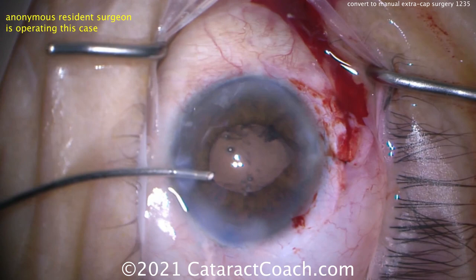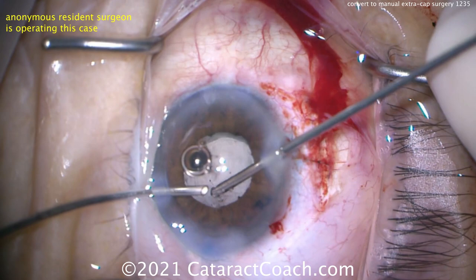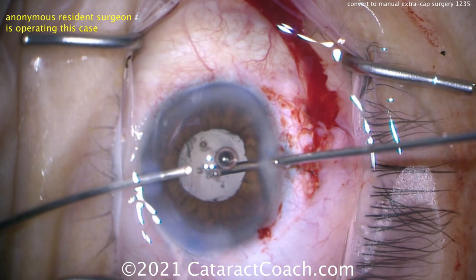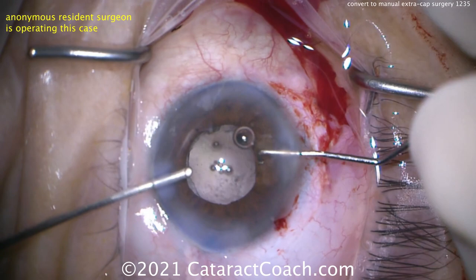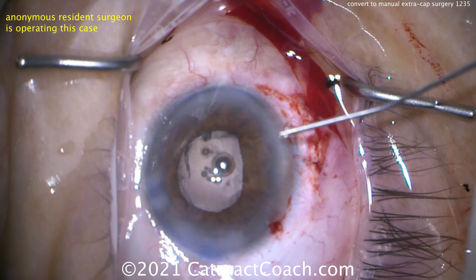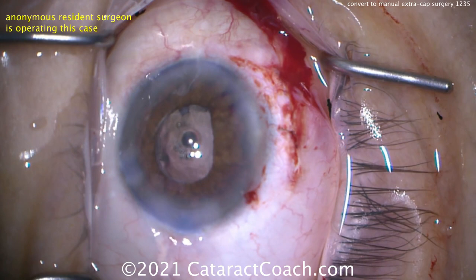I think you can learn to control your foot and do a good job. Cleaning that up — it looks pretty good. You can tell there's vitreous prolapse. Here comes some triamcinolone. Surprisingly, not a whole lot of staining in the anterior segment. Doing IA cut mode again to remove lens material — you want to get that and make sure it doesn't fall into the vitreous. These patients with a complication like this need careful retina exams in the post-op period. This patient can still have a beautiful outcome. Looking around with the chopper — is there sufficient capsule support? Yes, there is sufficient support for a sulcus lens, and really not much residual cortex remaining.